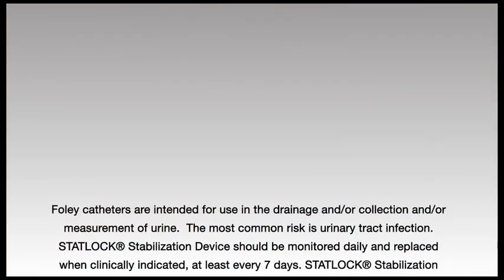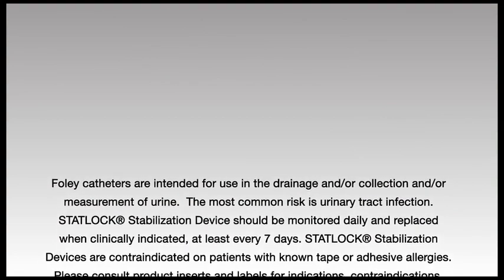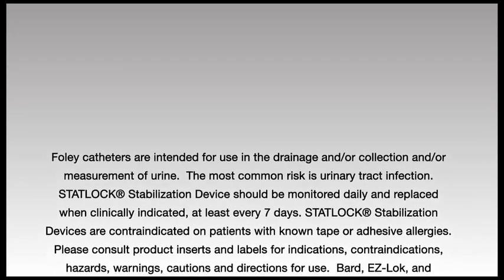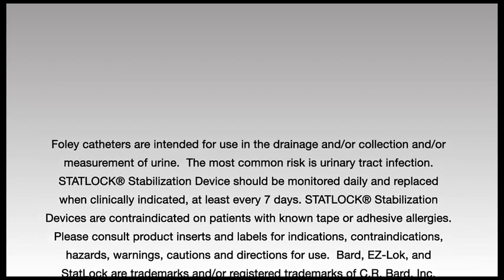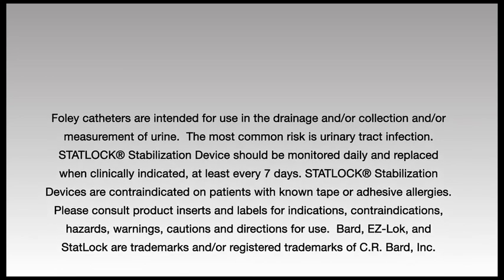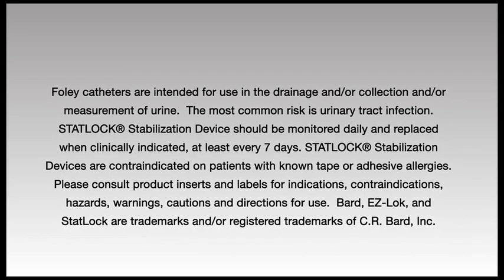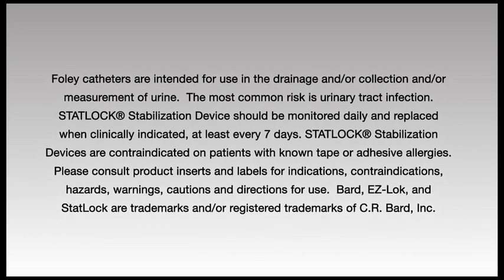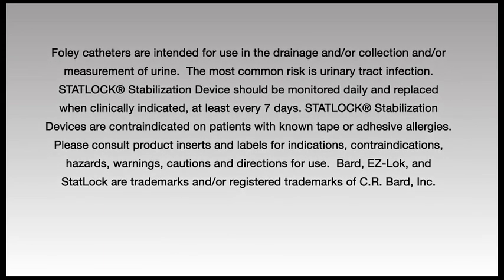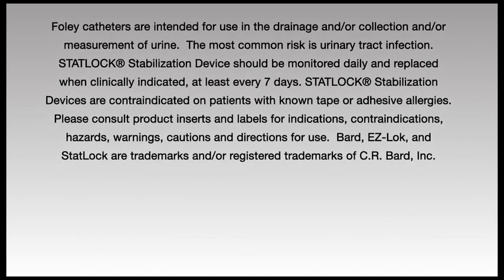Foley catheters are intended for use in the drainage and/or collection and/or measurement of urine. The most common risk is urinary tract infection. StatLock stabilization device should be monitored daily and replaced when clinically indicated, at least every 7 days. StatLock stabilization devices are contraindicated on patients with known tape or adhesive allergies. Please consult product inserts and labels for indications, contraindications, hazards, warnings, cautions, and directions for use.